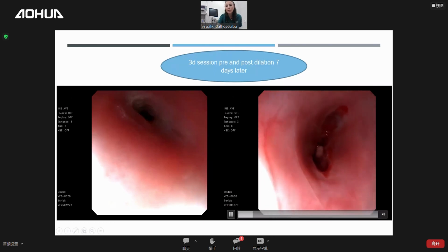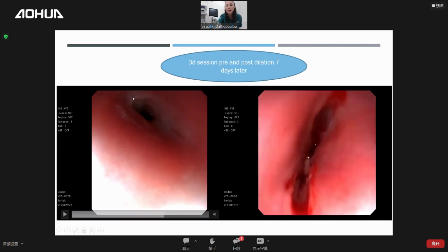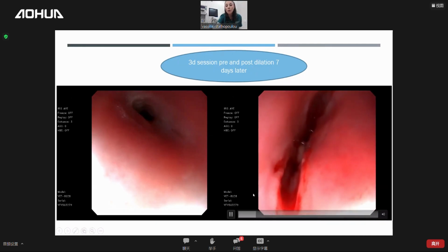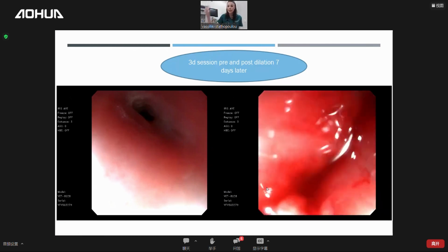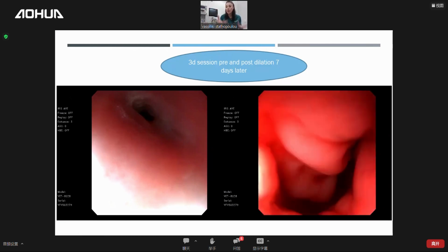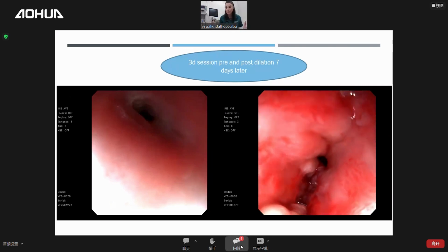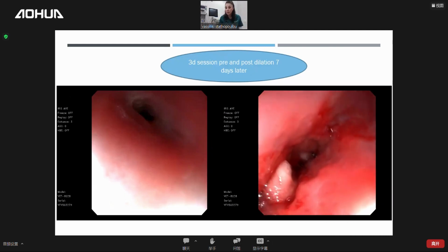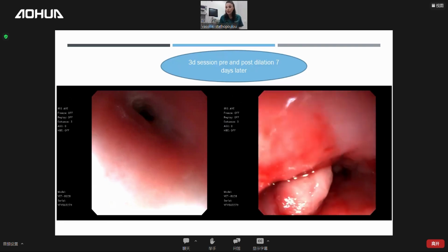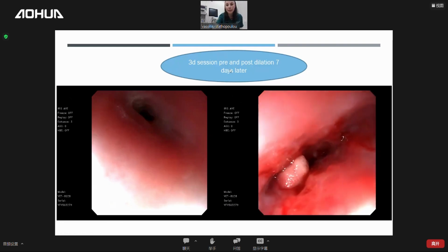I'm not showing the balloon dilation because it's the same thing, the exact same thing. And the result is that from this diameter, we went up to all this tearing of the esophagus as well. Again, and again, and again, every 3 or 4 days. You might need 7, 8, and clinically now, this cat was much, much better. She could swallow canned food without even putting it in the blender. But we had to do the procedure, even though this cat was not regurgitating.